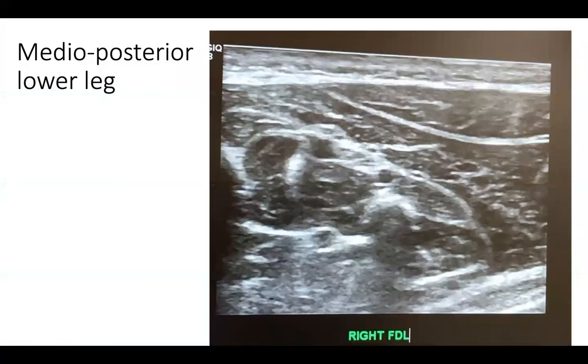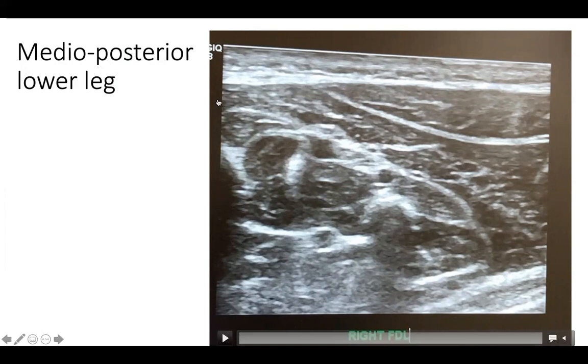And then we're going to take a look at the video from the place where we put the probe. This is the child leg. So you can see a lot of structures in the posterior part of the leg. And as we learned, this time the probe was flipped over, so tibia is on the left side of the screen. So tibia, you are putting the probe here, right?